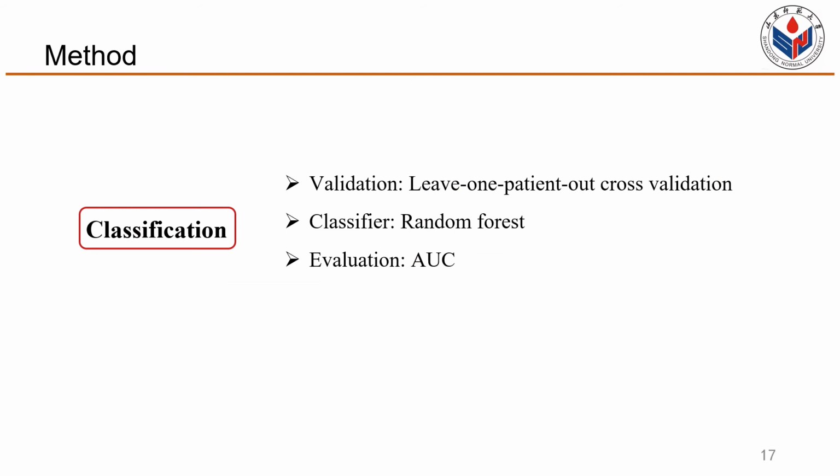For classification, since the dataset we used contains a limited number of cases, we performed leave-one-patient-out cross-validation. The random forest is used as the classifier, and we calculate the area under the ROC curve to evaluate the classification performance.